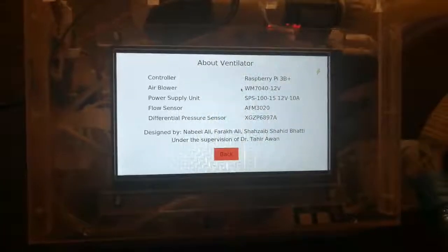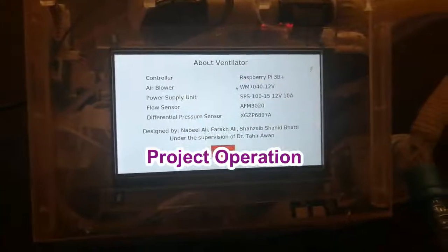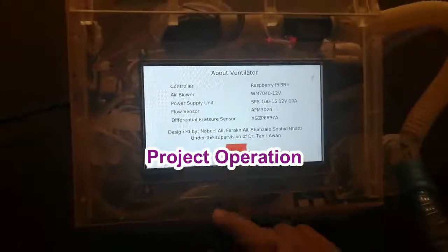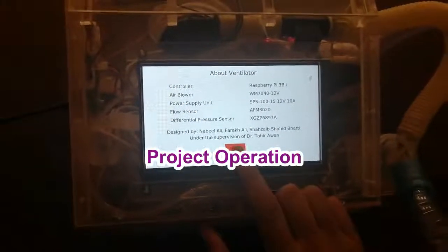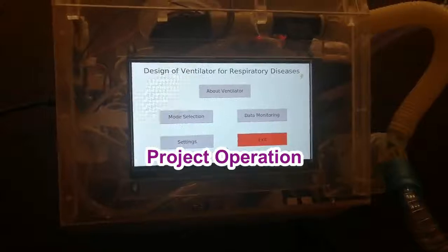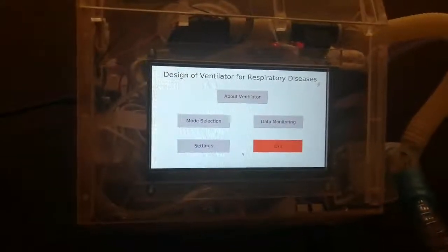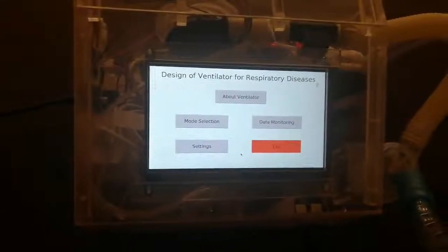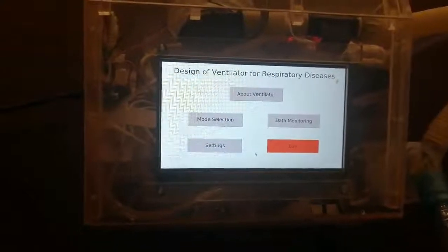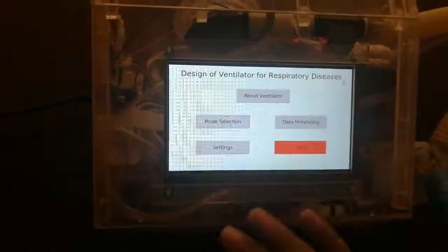This is the main interface of the ventilator. Here you have options for mode selection and data visualization. You can also exit the ventilator app. Press the mode selection button.